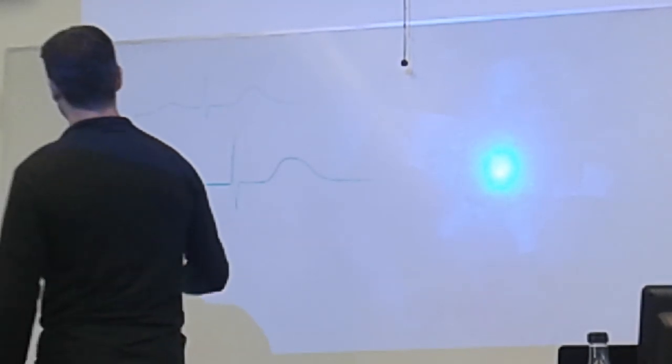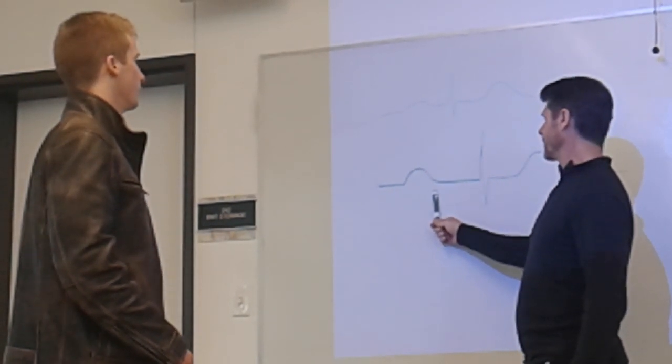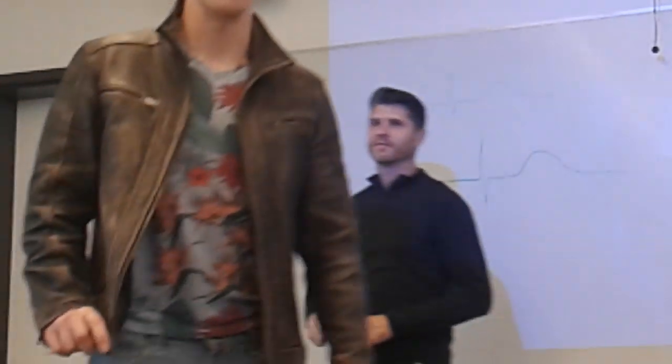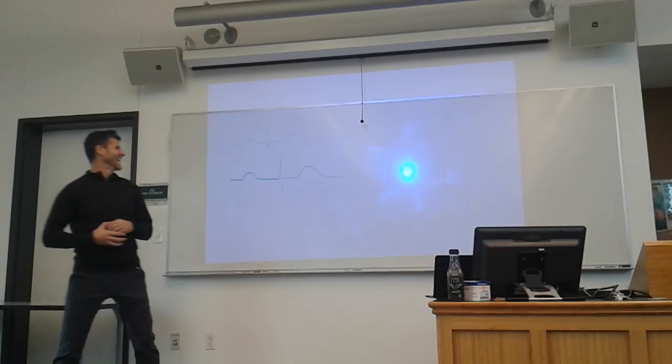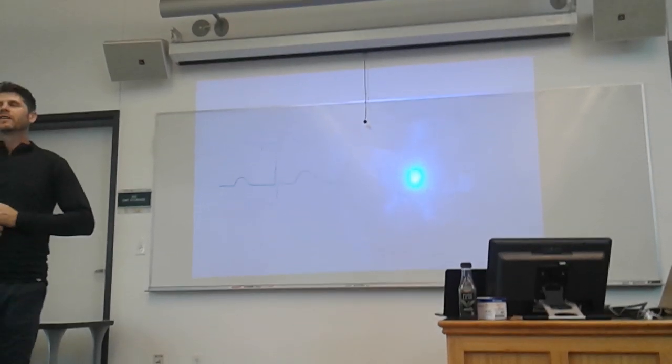They said that they had a P wave, and then that P wave happened, and then the AV node had a longer delay than normal. Yeah, I just thought you might see a U wave, but no. Okay. Everyone agreed except for you.